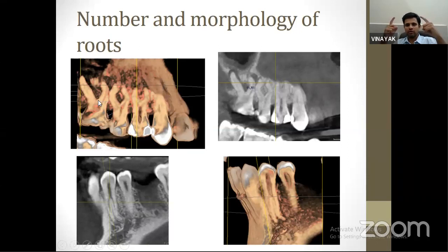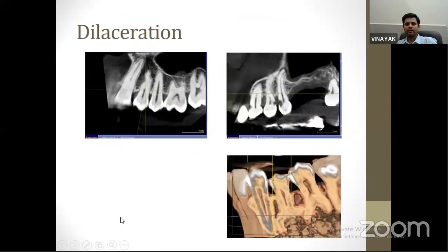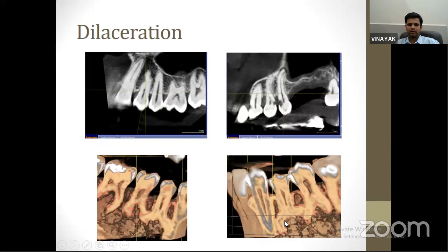And these are also curved like the horn of a cow. This is the maxillary premolar having two buccal roots. Also, if you see this mandibular premolar, it has two roots. This is the first premolar, the second premolar, and the first molar is missing. So you can see there are two roots and two canals in this, and these are also curved. Also in this case, you can see the curvature of the premolar, even here.